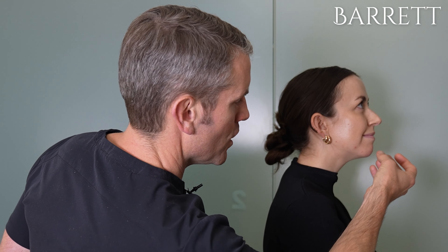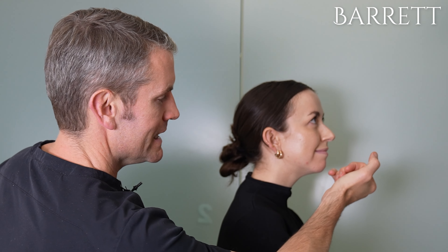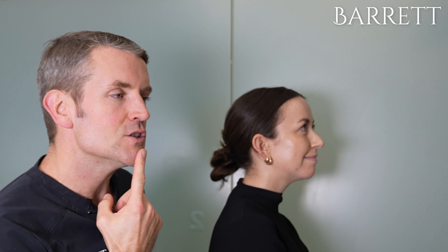So here's our beautiful patient. If she turns to the side, you'll see that we have a good chin, but she wants a little more fullness here in the front so that it matches that lower portion of the lip. So we want a little straight down, drop down — that's where we want the chin to be. We're going to take care of that for her today with some numbing medicine. There's going to be a little bit of swelling, but literally this can be done on your lunch break.